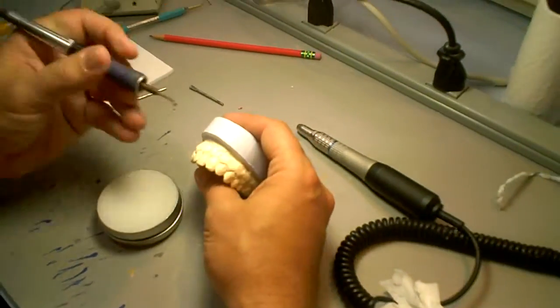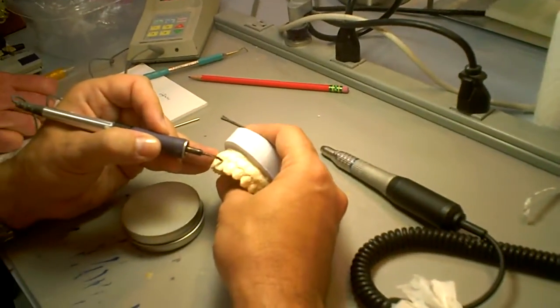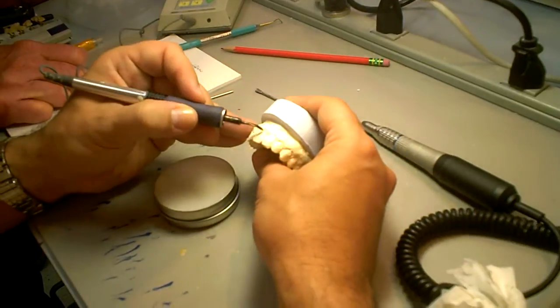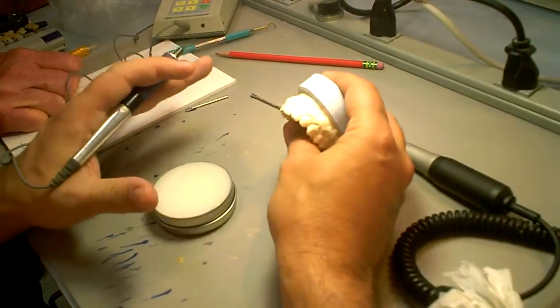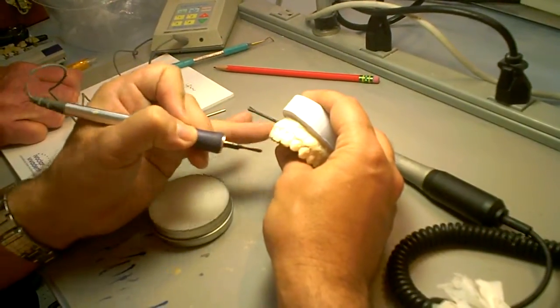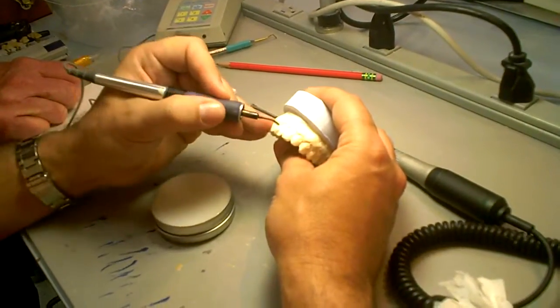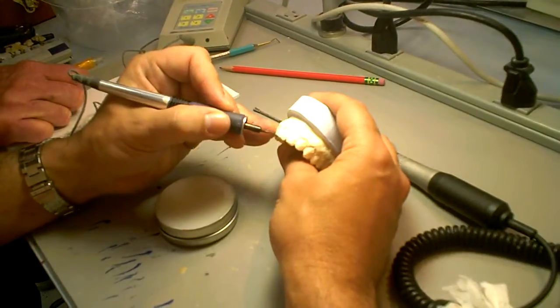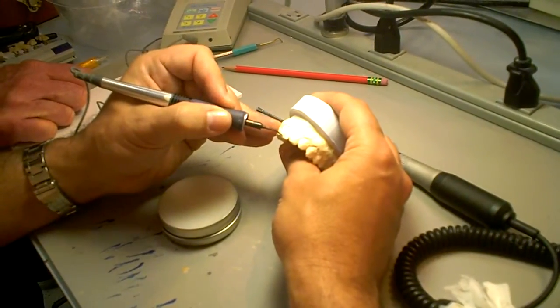Then it comes to this little height of contour. So now my tooth is coming alive. I know that everything's going and I'm following this line here. So all I have to do now is just fill in the gaps, right here and right here.